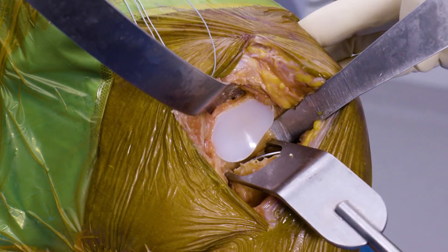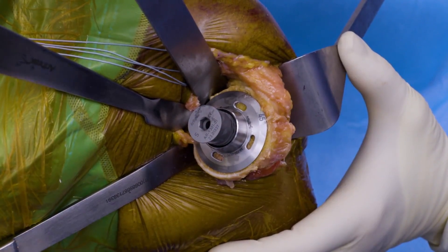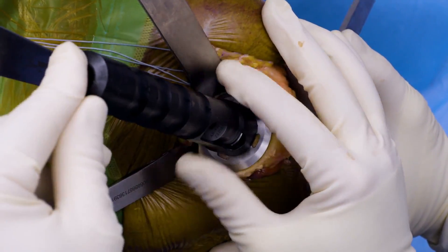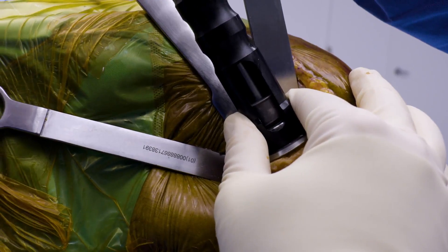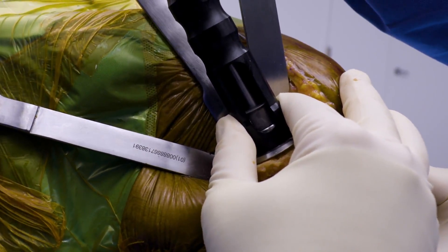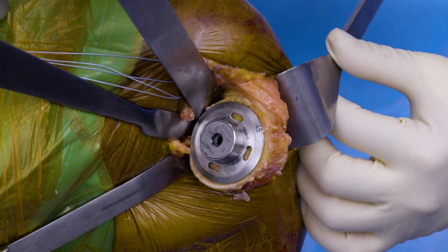We're ready to proceed with our Eclipse. Our cage screw already has our bone graft. We're going to center our cage screw in. We're going to apply our tower here. I want to see this window and I want to apply force all the way around so it stays flat. Insert our driver with good axial pressure and slide this down. Excellent. Take all of this off and then we'll trial our humeral heads.